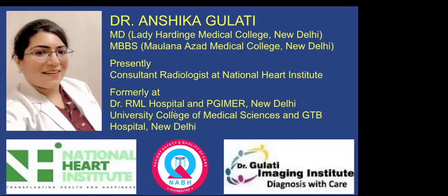Today's session is a follow up session on the previous talk by Dr. Anshika Gulati on the segmental approach to congenital heart disease. In the last talk, she discussed how to approach a congenital heart disease, and today she will be illustrating those principles which she had outlined in the previous talk with cases. Welcome, Dr. Anshika, for today's talk, and over to you, ma'am.